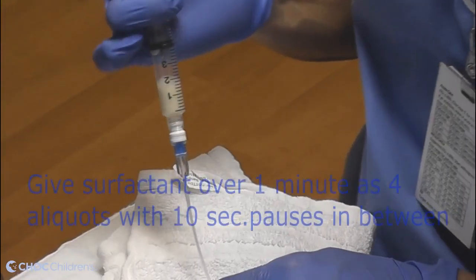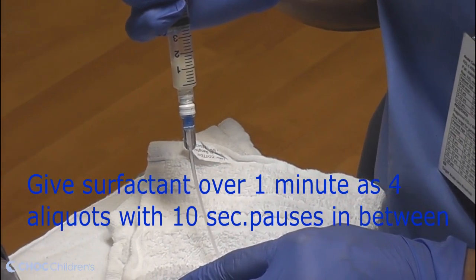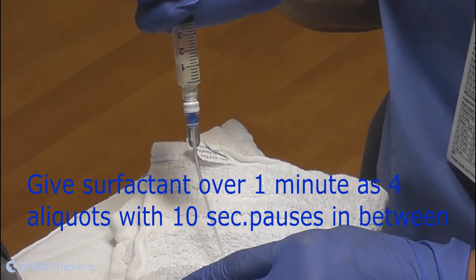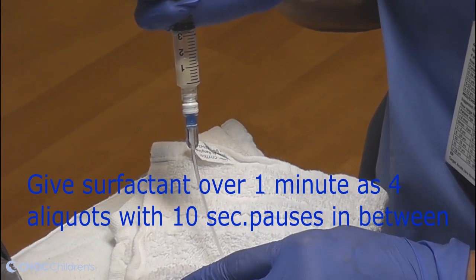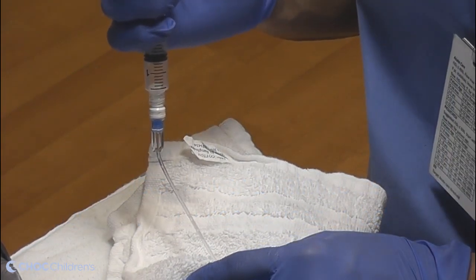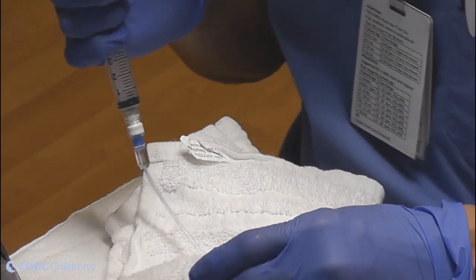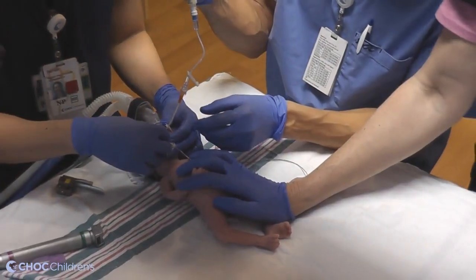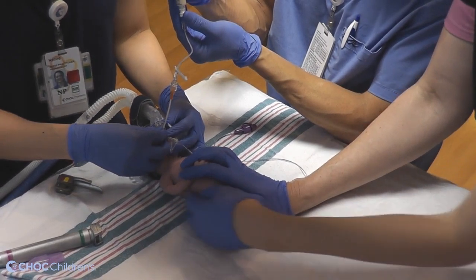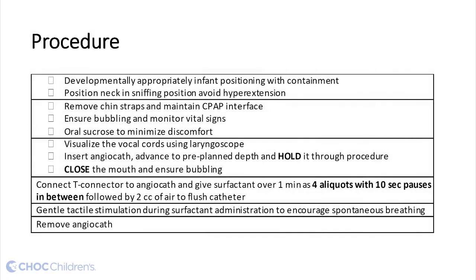Next, you will connect the T-connector to the angiocath and slowly instill the surfactant over 1 minute. This will be given in 4 aliquots with 10-second pauses in between, followed by a 2 milliliter bolus of air to flush the catheter. Remember to provide gentle tactile stimulation during surfactant administration to encourage spontaneous breathing of the baby. Lastly, you will remove the catheter.